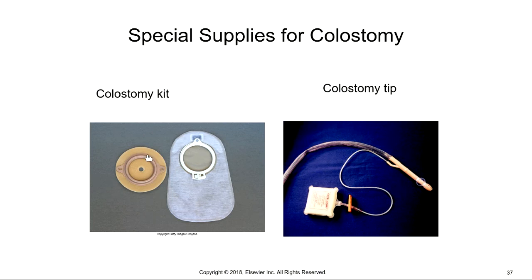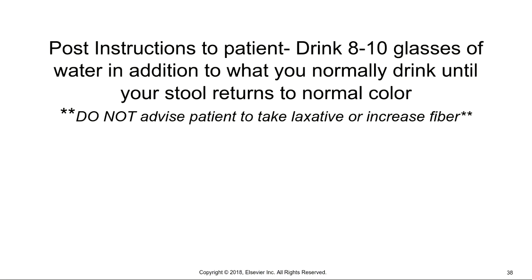Once you're done with any of these, whether it's a double contrast study, your evacuative proctography or your defecogram, or the colostomy enema, what you have to tell the patient, as with any fluoro procedure, is that they need to drink 8 to 10 glasses of water in addition to what they normally drink until their stool returns to a normal color. And I just added, please do not advise your patient to take any laxatives or to increase their fiber. If they have those kinds of questions for you, make sure you direct them back towards the doctor that ordered this exam.